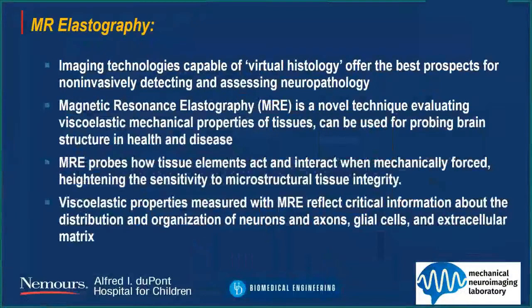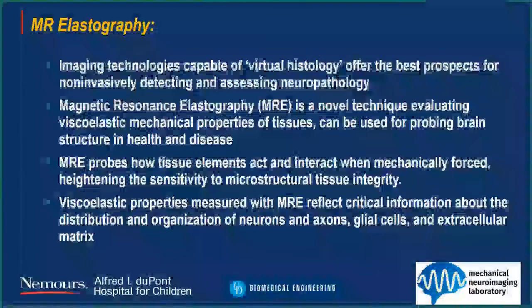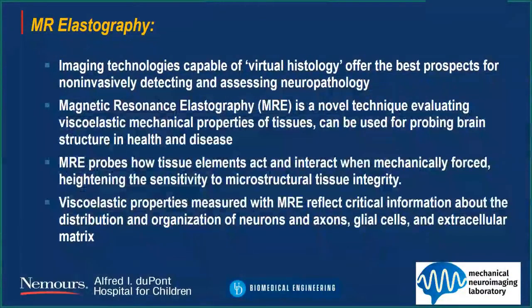Imaging technologies which are capable of offering virtual histology have the best prospects of non-invasively detecting neuropathology. And MR elastography is one such novel technique which helps in evaluating the viscoelastic properties of the tissue. These viscoelastic properties heighten the sensitivity to microstructural tissue integrity.